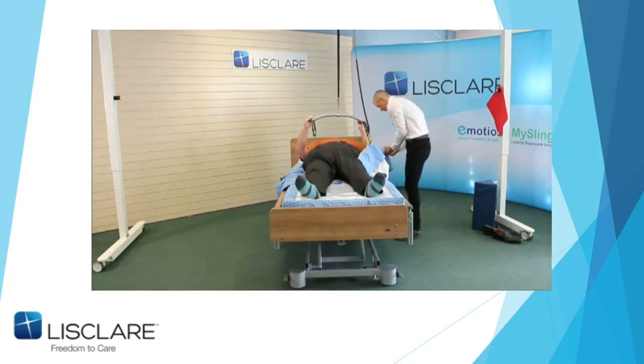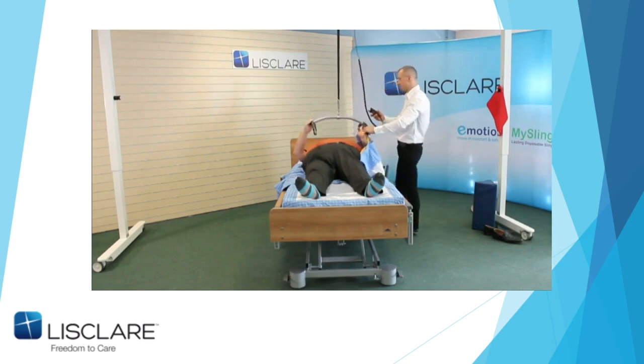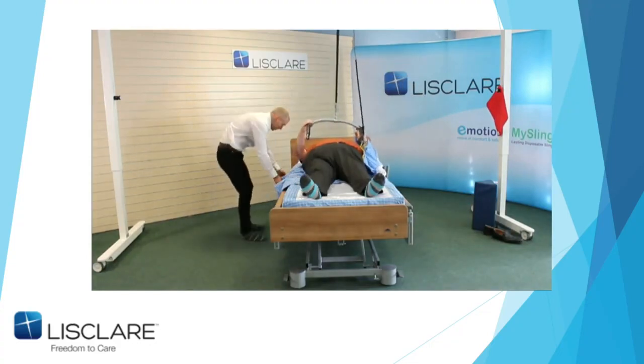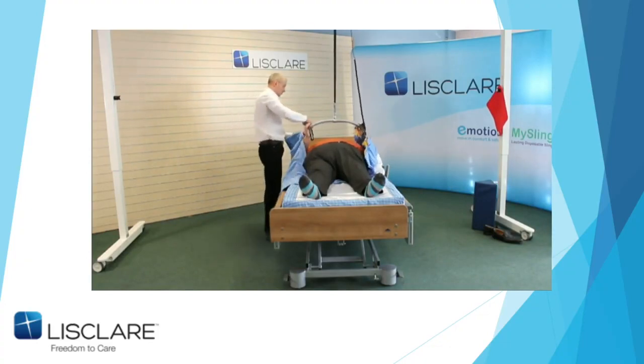Now, in the person's house, especially if it was being nursed myself, I'm sure the OTs would agree that I would have an H system overhead hoist built in. And I've done this with a 44 stone lady, whose husband was the sole carer, who weighed about 10 stone. So that gives you an idea of what you can achieve with an H system hoist.